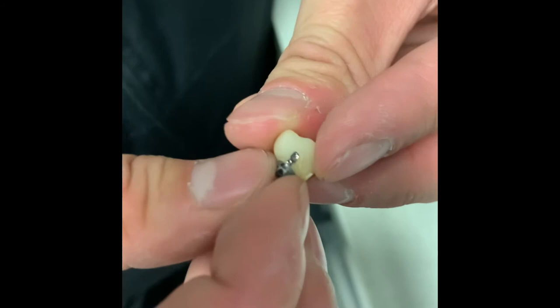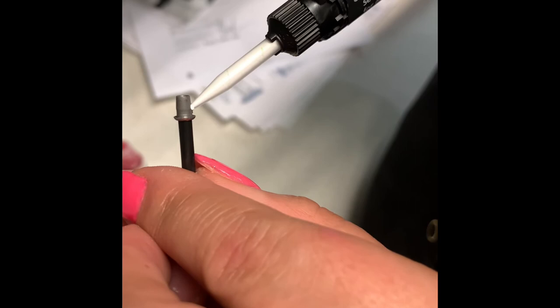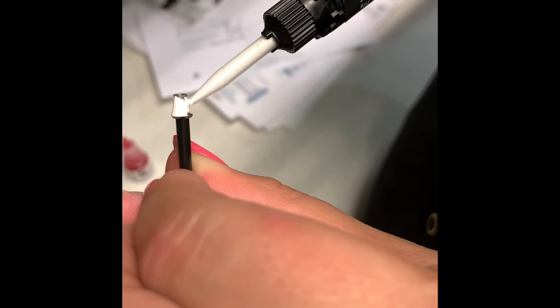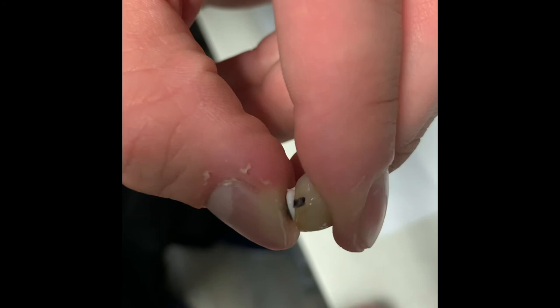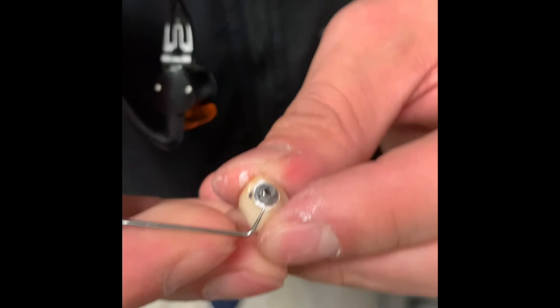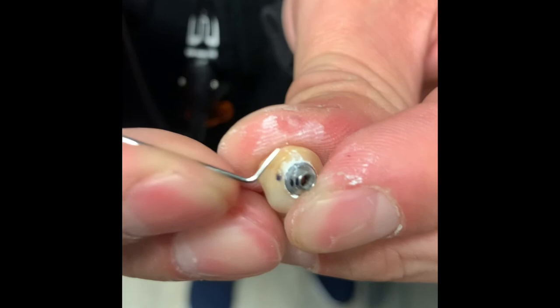So we're just going to add some multi-link hybrid cement to this — that's an Ivoclar product, self-curing. I'm just going to get that all on the tie base. I'm using a stirring straw from Costco to hold the tie base. So that went in. You don't get rid of any of that excess right now — you just hold it down for two to three minutes. Don't remove any excess. Now that you've cemented this for two to three minutes, you can remove all this little excess cement. And you can polish this off too with polishing burrs and stuff like that.